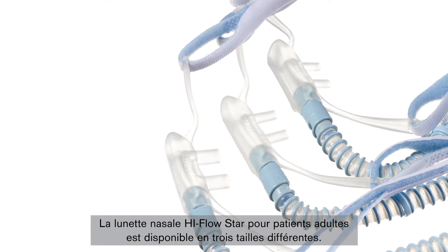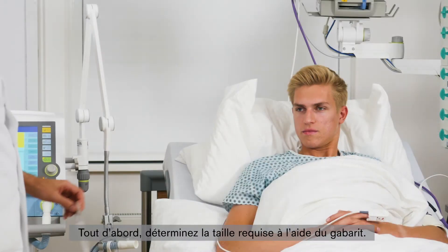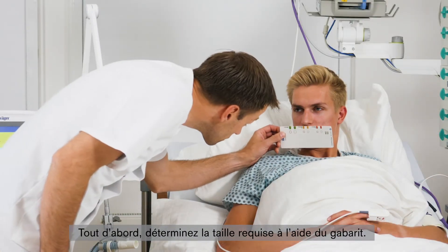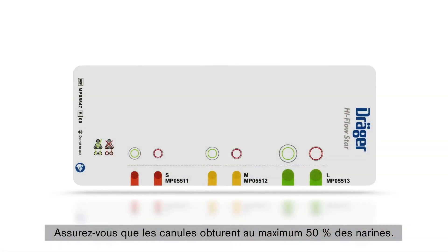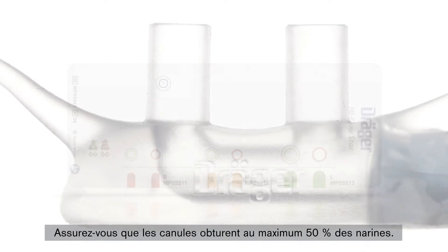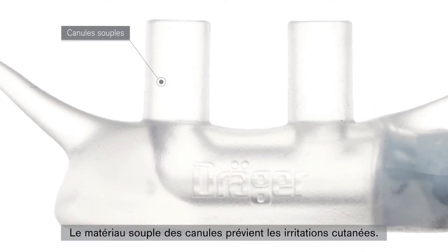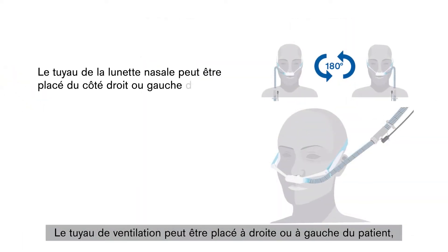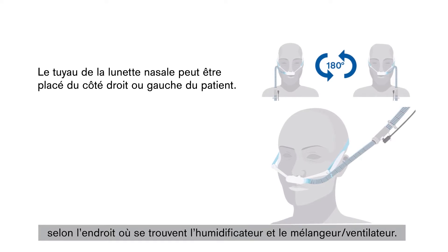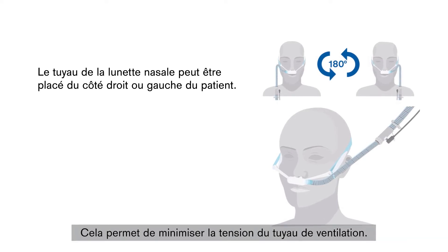The High-Flow STAR nasal cannula for adult patients is available in three different sizes. The required prong size is established using the sizing gauge. Ensure that the prong only closes up to a maximum of 50% of the nostrils. The soft prong material helps to prevent skin irritation. The breathing hose can be placed to the right or left of the patient, depending on the side on which the humidifier and blender or ventilator are placed, to avoid the breathing hose being put under too much pressure.